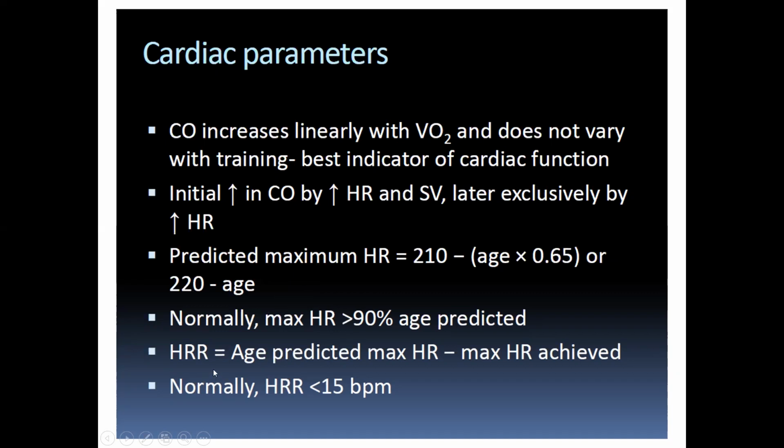Heart rate recovery, I told you that if your heart rate recovers less than 12 beats per minute in a minute, the difference is that it has only come down by 12 beats from peak to 1 minute.